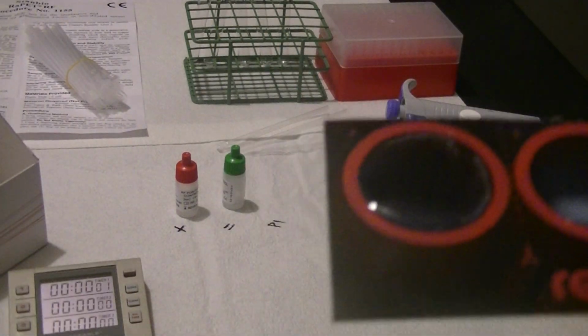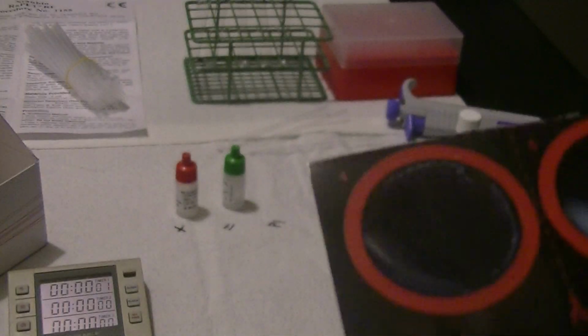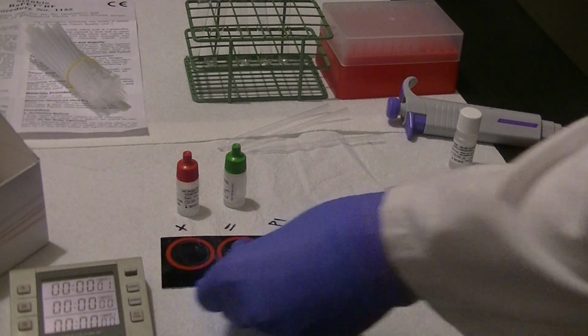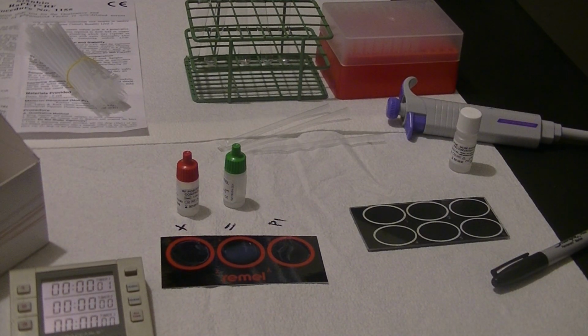All right, so you can see our positive control does look very positive, with white clumping particles. Our negative control is still just a milky white suspension with no clumps, and our patient is very positive. So this test would be reported as positive for patient 1.